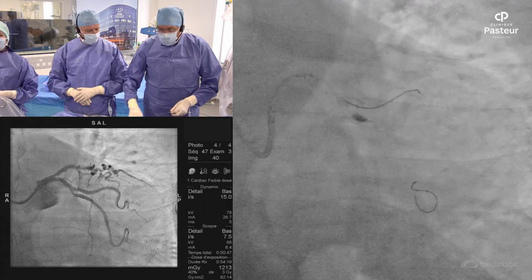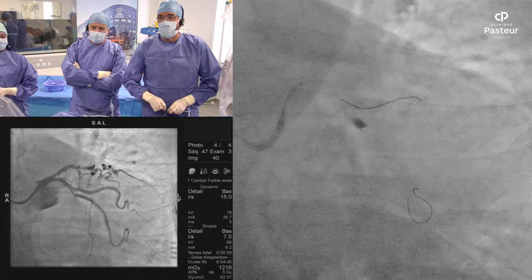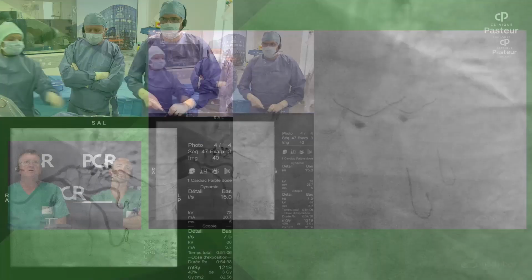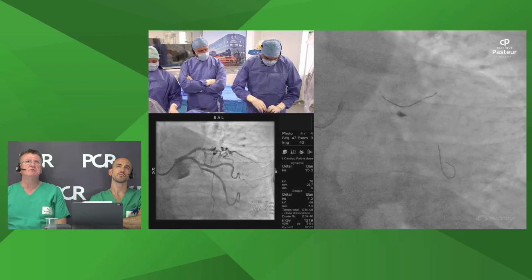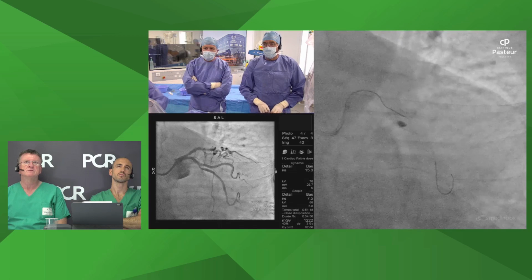An anchoring? I don't know. We can do an anchoring, but again, by wire. When I feel the difficulty here, I will say that maybe it's effective to try the guideliner. So if you put the balloon where you've had it, you can bring the guideliner down over the balloon. That's the only way you'll get the guideliner there. And if it's close to the exit into the OM2, then you may be able to deliver the stent there. Yeah. So I have to try.